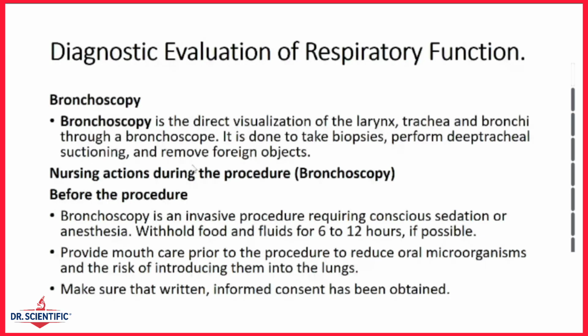Usually, it's used to inspect the trachea and the bronchi for tumors, for infection, for inflammation, or presence of foreign bodies. It can also be used to obtain a sample for biopsy, and diagnose diseases like lung cancer and TB.